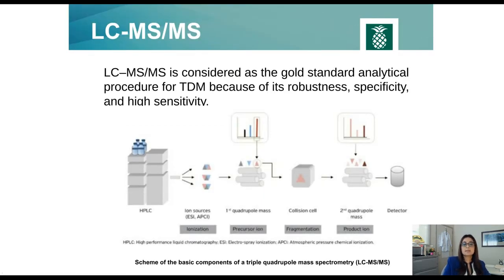The LC-MS combines the separating power of liquid chromatography and the high sensitivity and selective mass analysis capability of triple quadrupole mass spectrometry. Next, we will describe the LC-MS method for measuring busulfan levels in plasma implemented and validated in our lab.